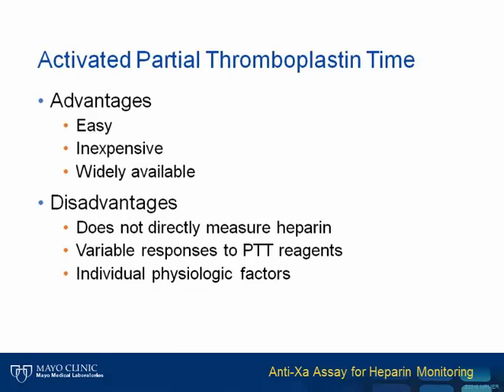The PTT offers many advantages. It is quick, cheap, and widely available. However, it does not directly measure heparin. Numerous PTT reagents exist, and each demonstrates a variable response to heparin therapy. Furthermore, several physiologic factors can impact the results of this clotting test.